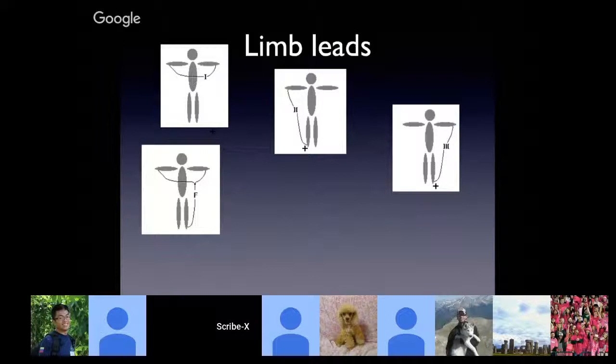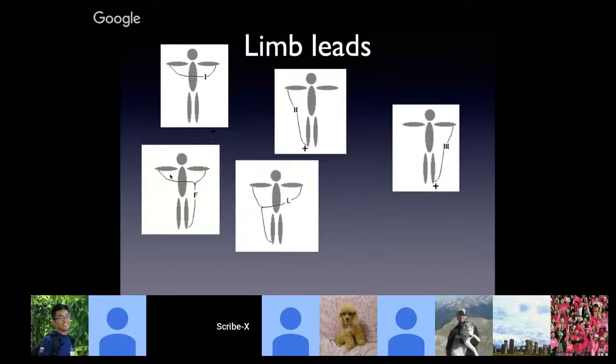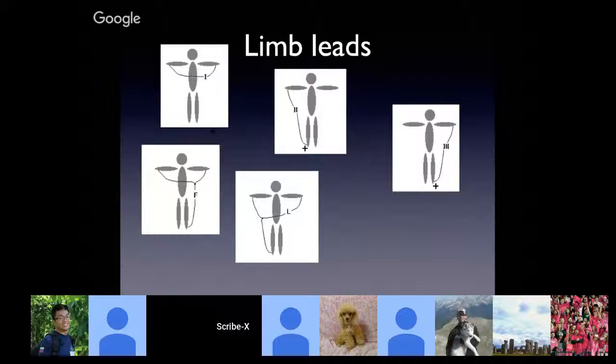And you can imagine sort of an XY axis and determine which direction these voltage potentials would take as they travel across the heart and down the limbs. And the augmented leads are variations on these directions.